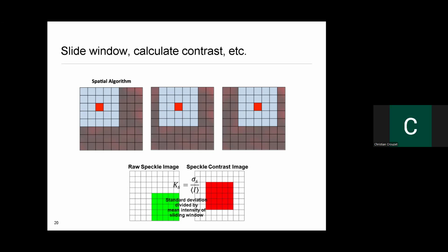Yeah, so the question was, can you alter the sliding window size? So yes, you can alter the sliding window size. Okay, so we'll save that for the lab later. So that's how we're able to calculate the speckle contrast.